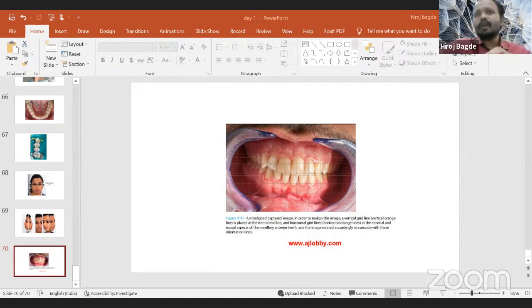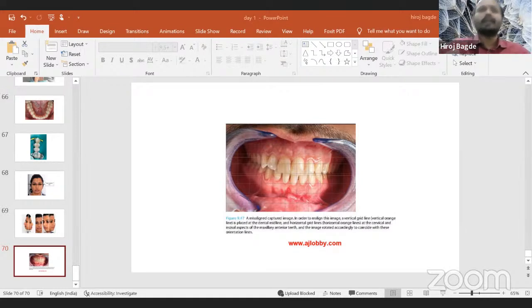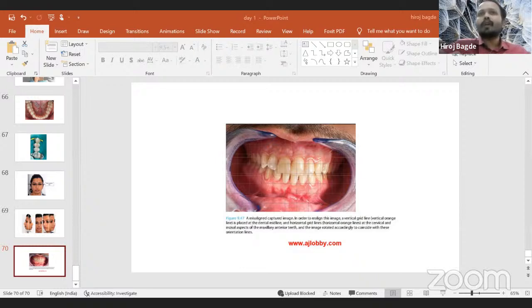The light is not going inside — can you see one side the teeth are not visible, while the whole teeth on the other side are visible? It is not a good image. The light is falling majorly on the cheek retractors and the central incisors. Can you see the central incisors are totally bright? We don't want this kind of image. We'll make it somewhat more beautiful so that it is at least somewhat acceptable. Go ahead for crop first — I selected 16:9. I'll just crop to the area needed, just going to the anterior aspects with some amount of cheek retractor.